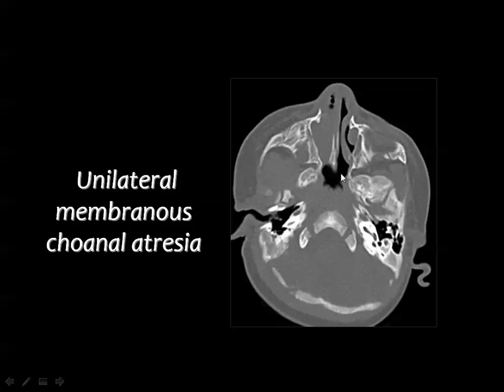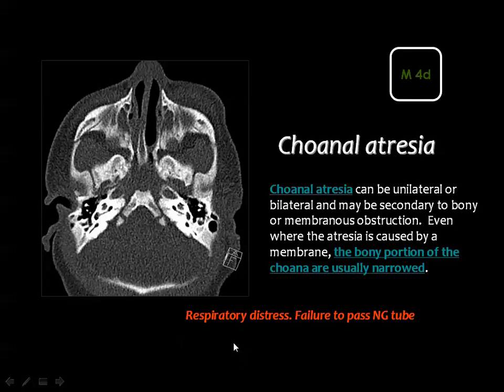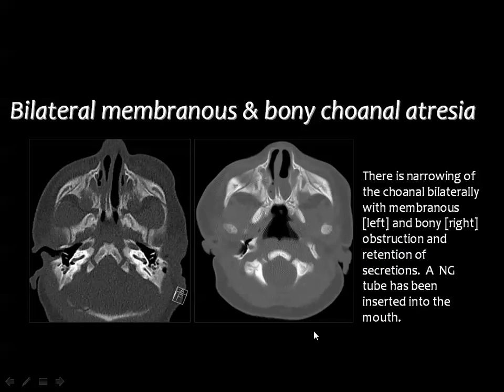This example shows a membranous type of atresia on the right side, with distension of the nasal cavity by secretions. Here you can see bilateral membranous atresia where the posterior choana is narrowed and a membrane is obstructing it posteriorly. These are two examples of bilateral osseous choanal atresia and bilateral membranous atresia in another patient.